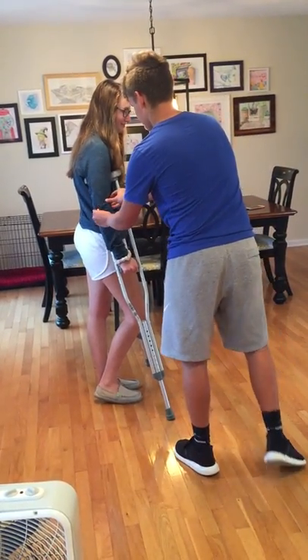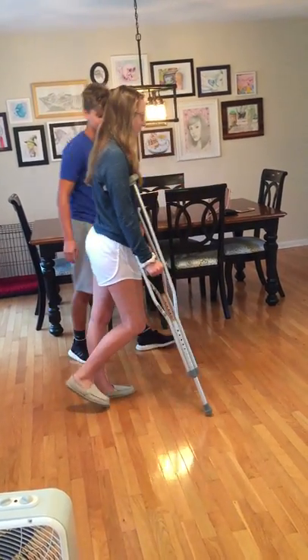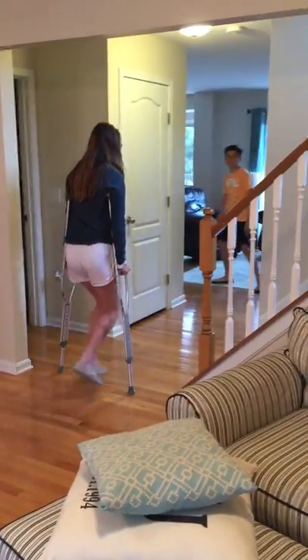Just make it a little bit. Yeah, that looks good. And then you want to put pressure on your hands and move yourself forward. That looks good.